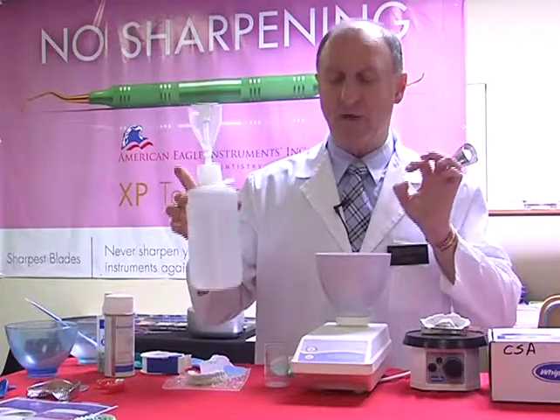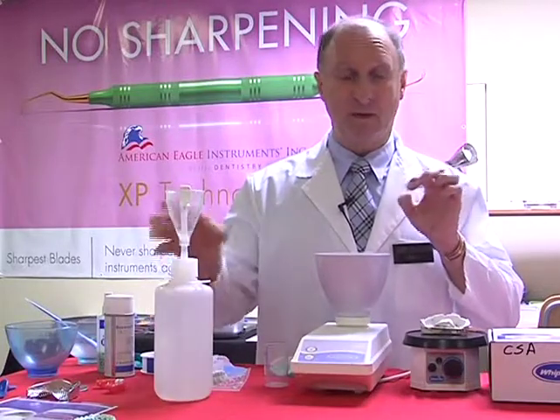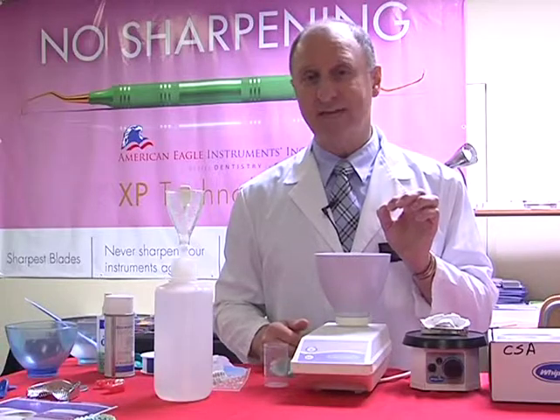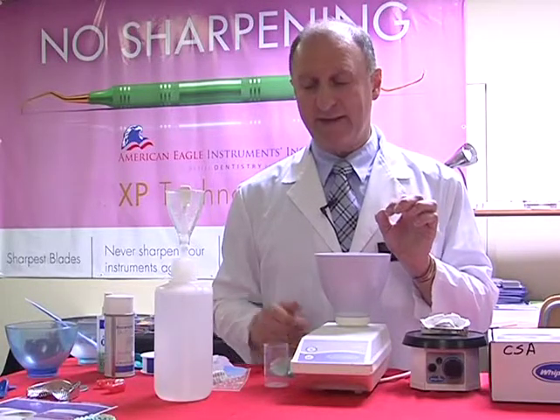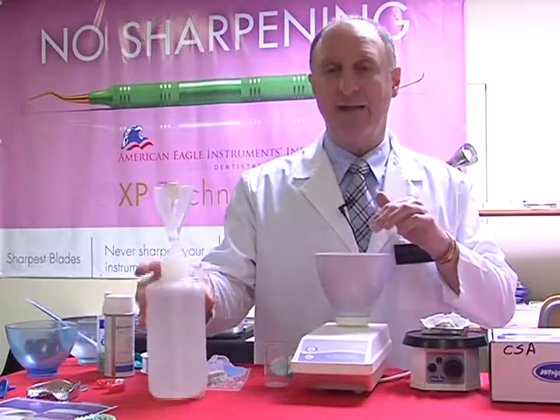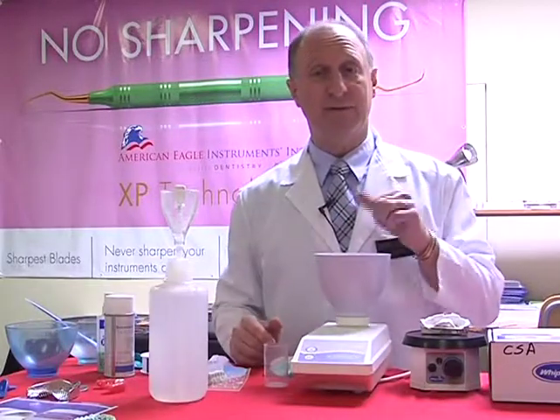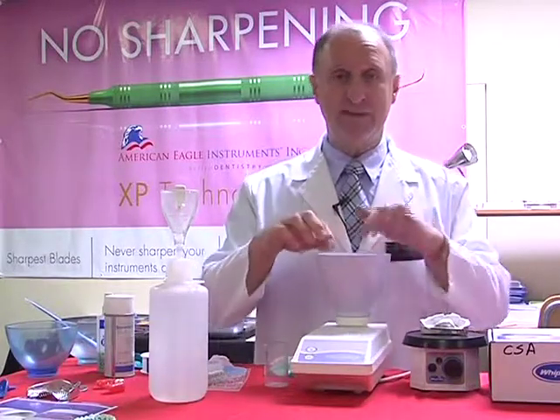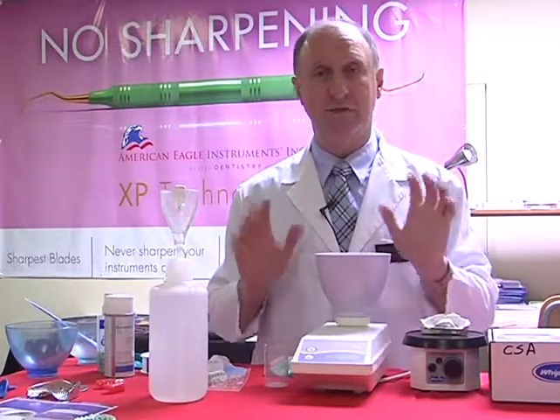Again, to accelerate stone set, rather than using just hot water, use a quarter teaspoonful of table salt. We would add that into our water and make sure it's fully dissolved, and then when we go to use it, it's going to accelerate the set. So normally a quarter teaspoonful inside, pour the water in, dissolve it, and then add your stone.